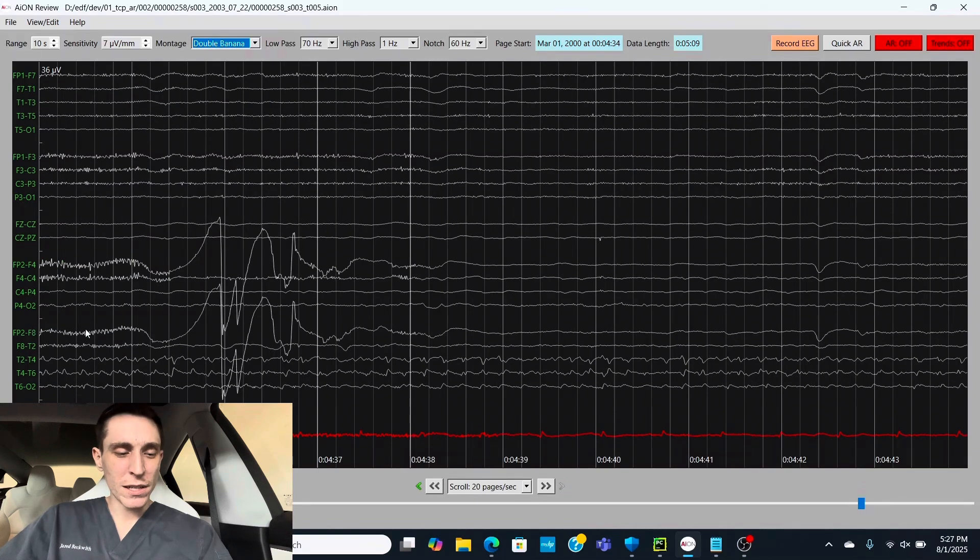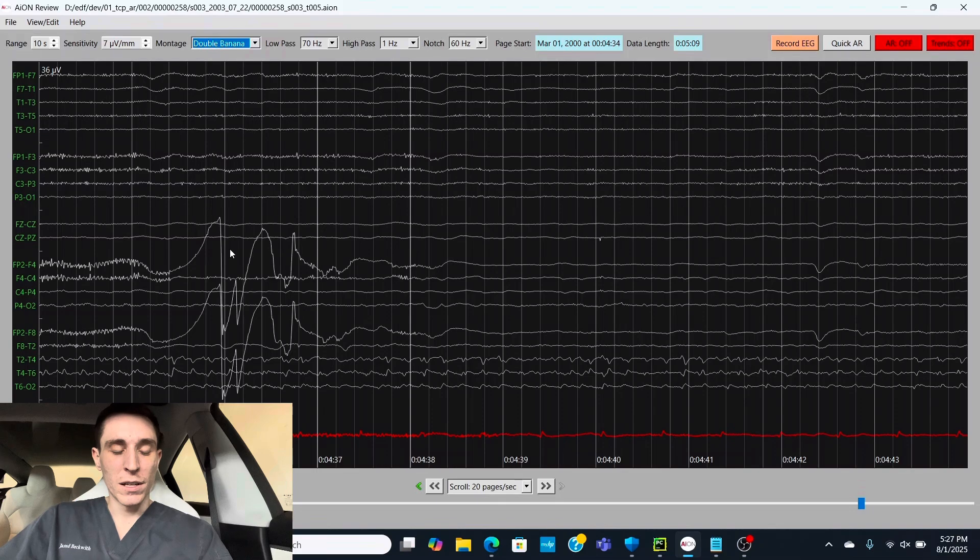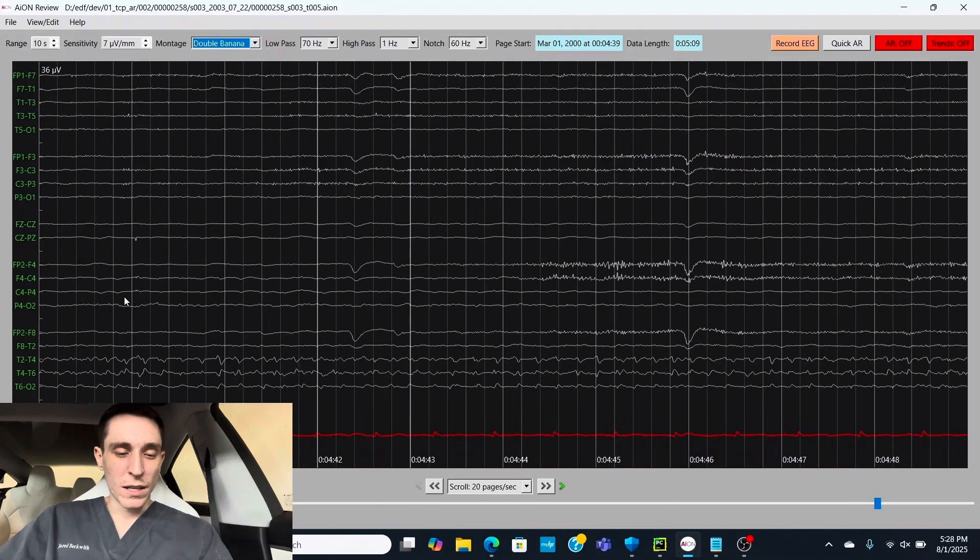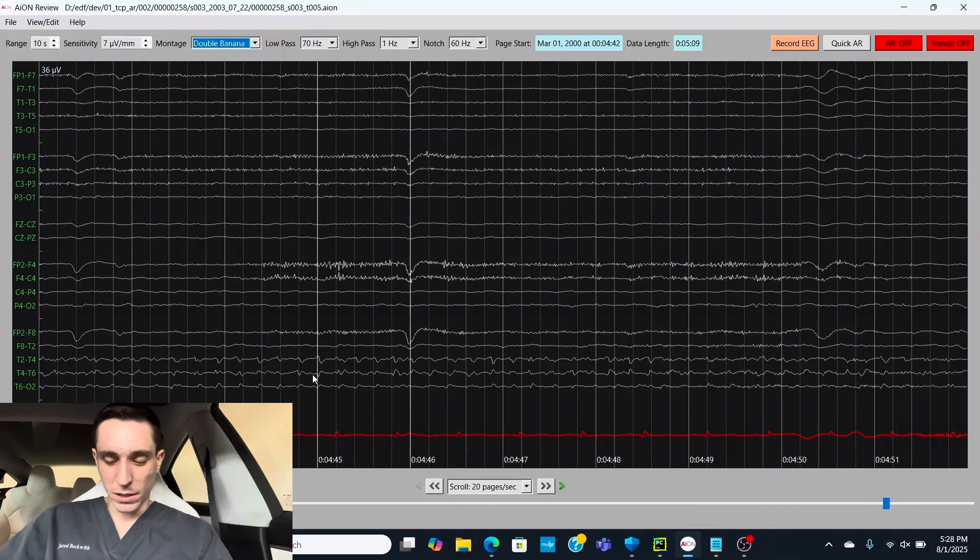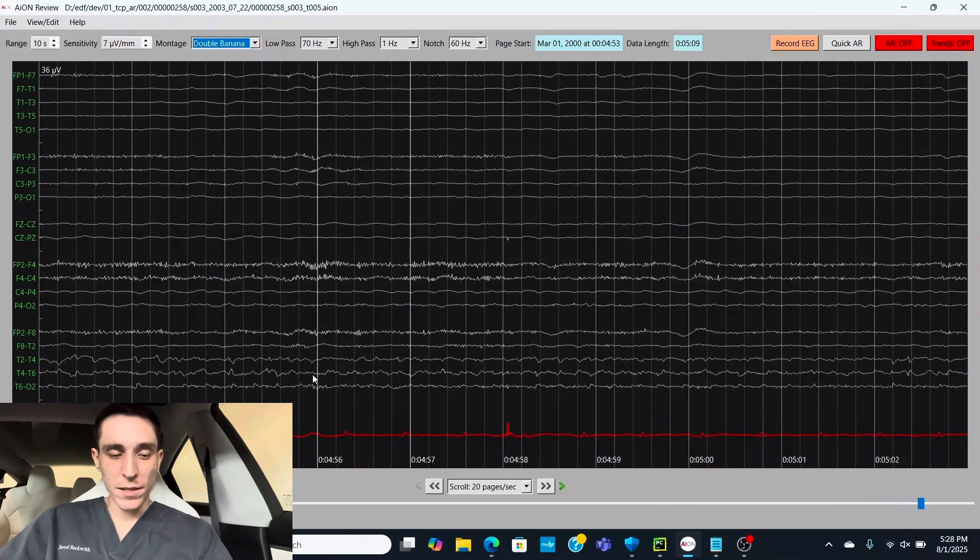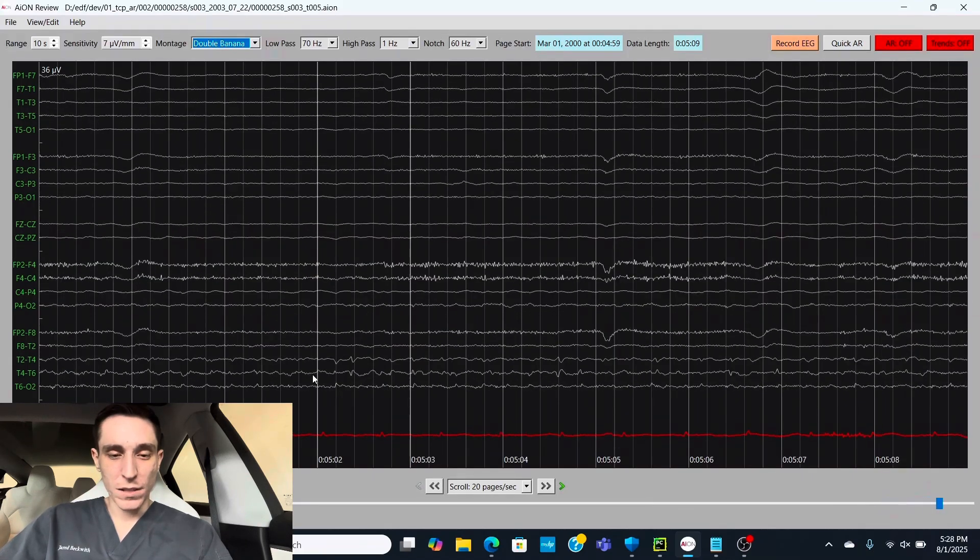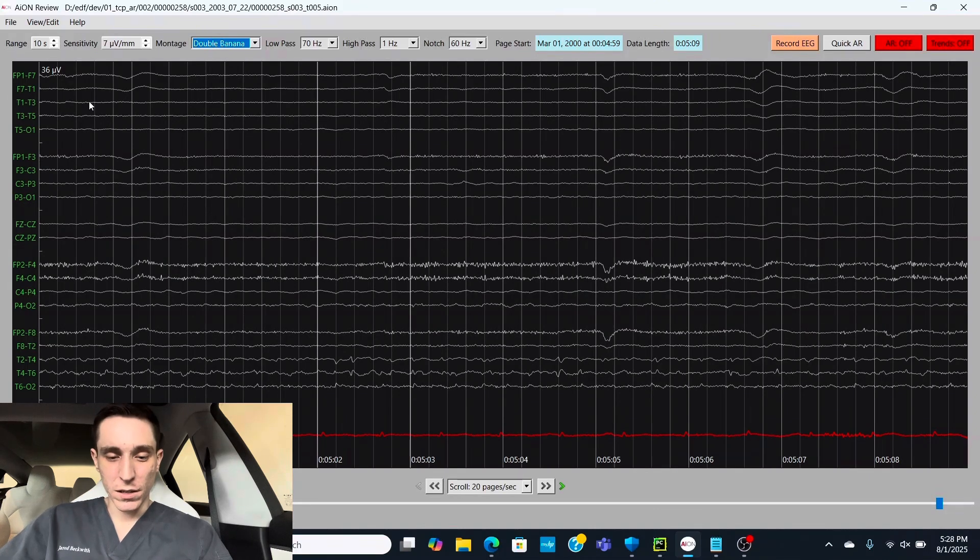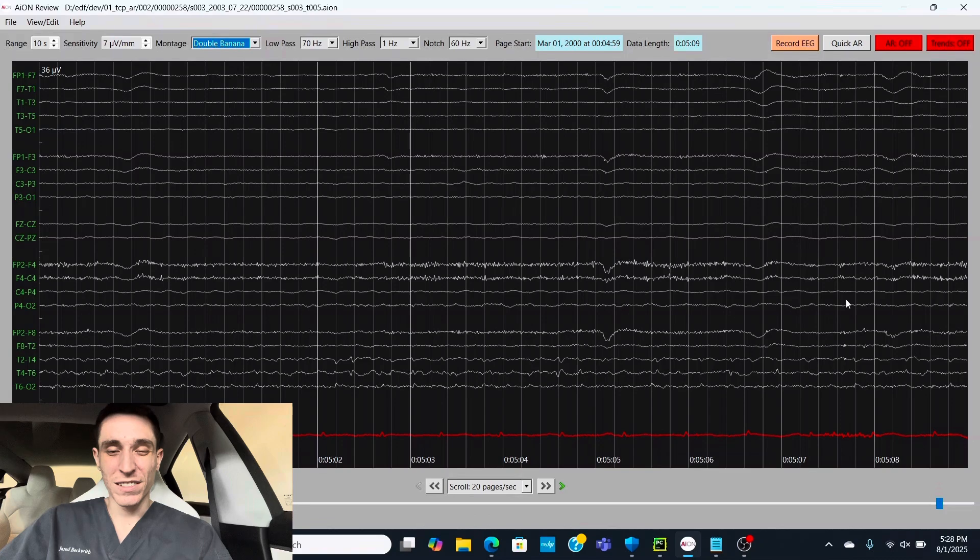Now here, this is an electrode artifact, FP2. So probably he's touching his forehead or something like that, or just movement. And we have the epileptic activity continue on at T4 compared to the other side, which doesn't have any. And we come to the end of this clip.